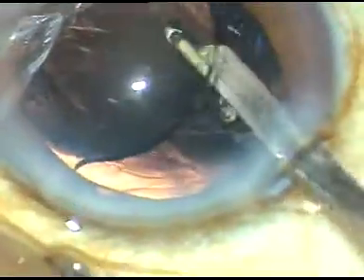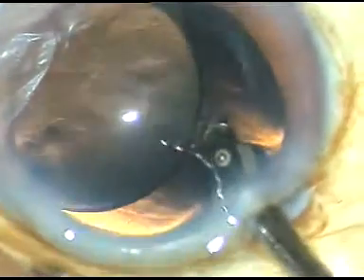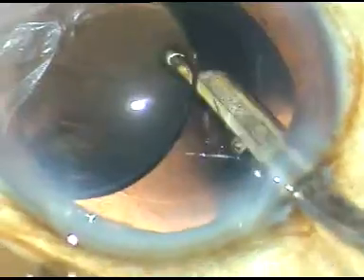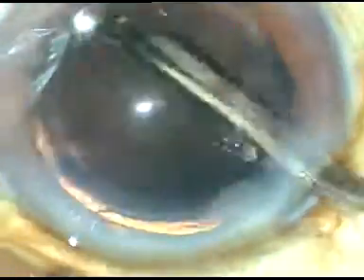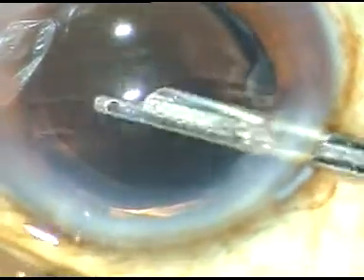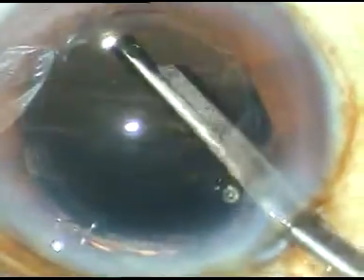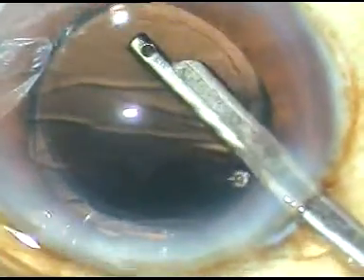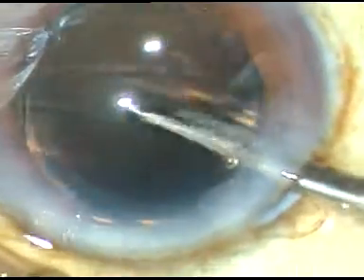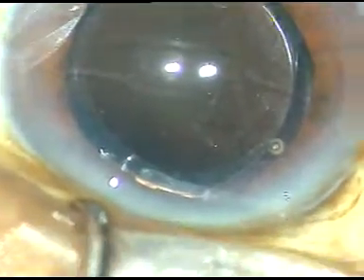First, I'm using the Simcoe cannula. I'm irrigating the area behind the IOL. I have irrigated in front of the IOL so that a lot of viscoelastic substance comes out just by irrigation of BSS. That's it. I take BSS directly from the bottle for this irrigation.